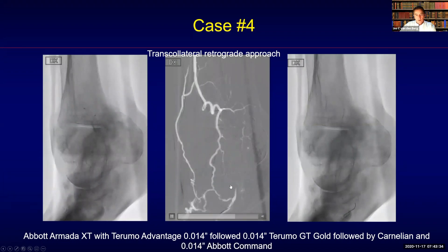Of course, we need to go all the way back. At this point it was possible, especially because the entire corkscrew disappeared completely, which enhanced the pushability of the balloon catheter — but at a certain point it was not possible to go any further.